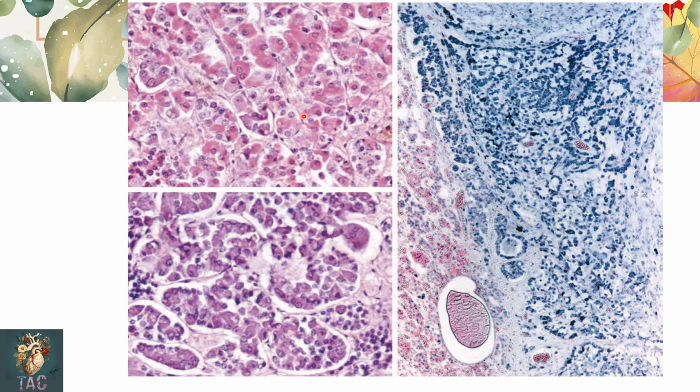So this is another diagram. Both of these are sections from the pars distalis of the adenohypophysis. But this section shows a large number of acidophils, and this section shows a large number of basophils. This is another slide. Here you can see this area is the pars intermedia.